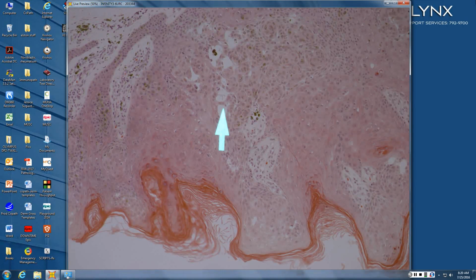Say maybe an irritated seb at first. Like an irritated seb, you see squamous eddies and you see spindling. Is it uniform throughout the lesion, or is it little circular clones? Little clones throughout. And is the normal epithelium pigmented? No. But are the clones pigmented? Yes. And then you see lymphocytes.